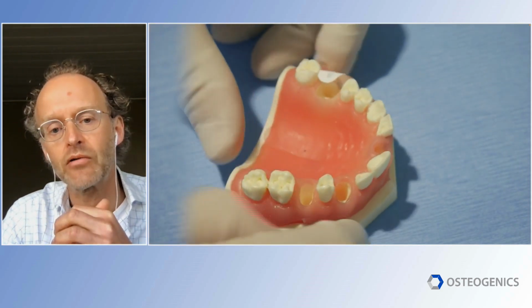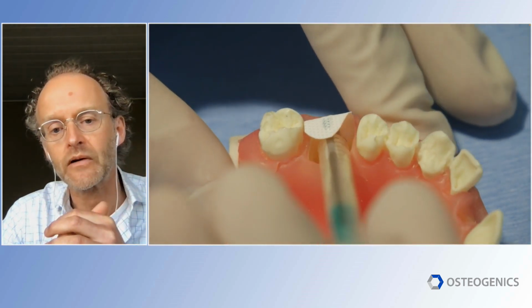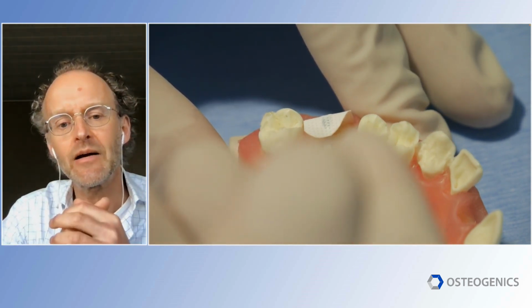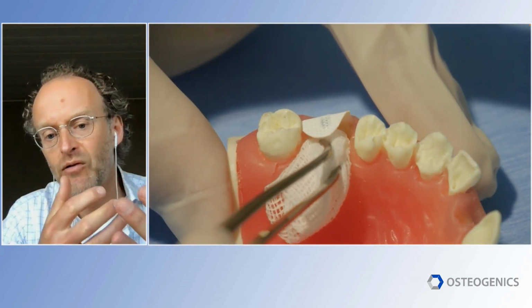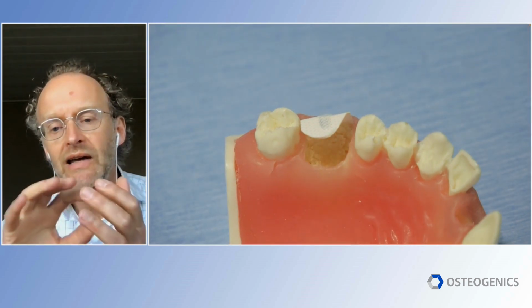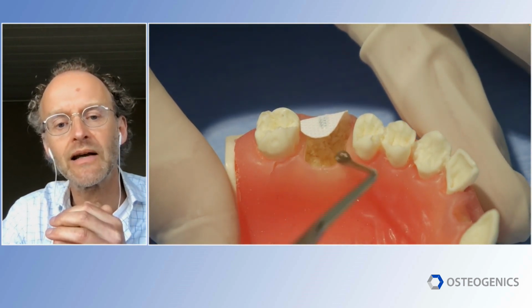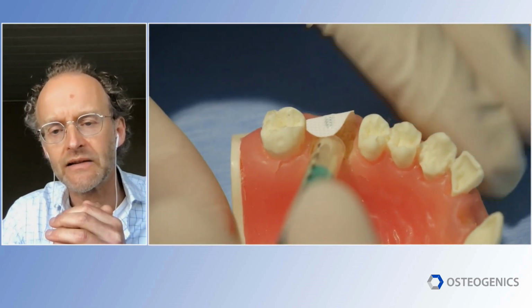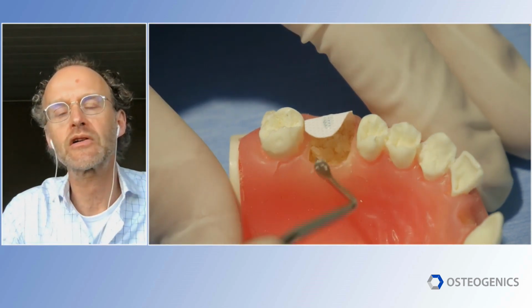And now we're gonna apply the bone graft. We always use an adjusted syringe where we put in the bone, so you can easily place it and have control. Normally, it's of course bleeding. I always use a cotton gauze to get rid of the excess of bleeding, and you can see where the bone material is. And then you condense it with the Lucas spoon, but take care not to overfill it. So always fill it up to where the original ridge borders were.